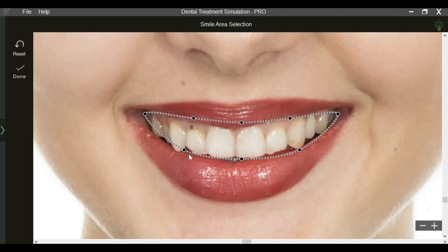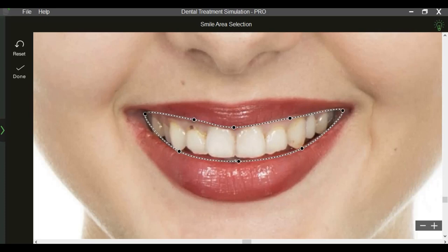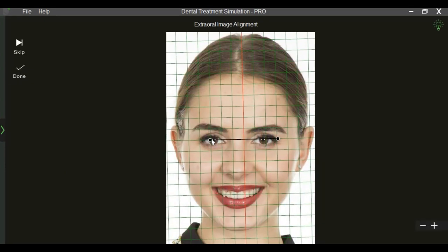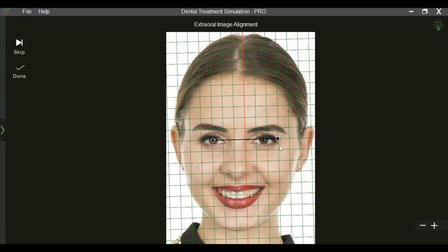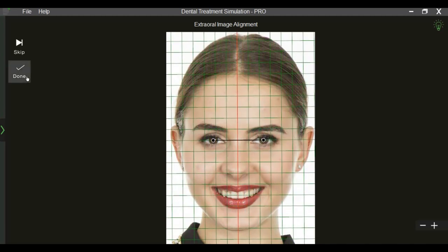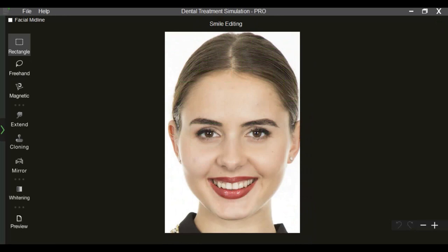The smile area has to be selected by left-clicking and dragging from one corner of the mouth to the other, following the lip contour. We then align the image by selecting the interpupillary line and set the facial midline.